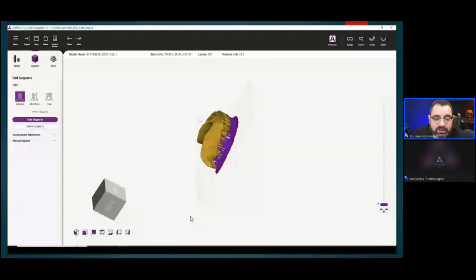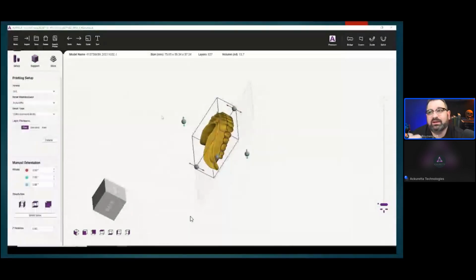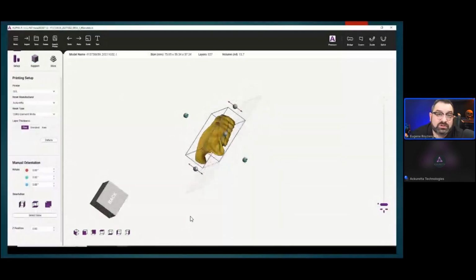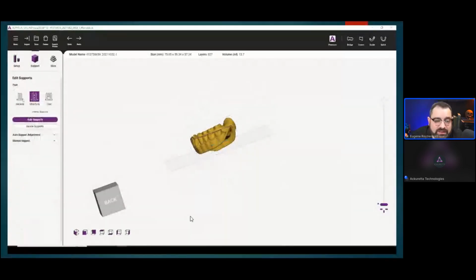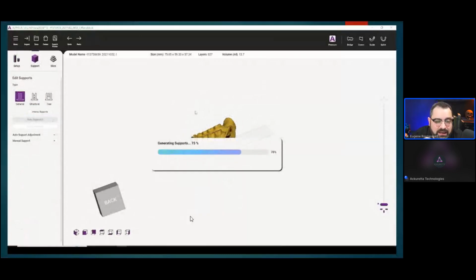This way will get you the cleanest possible intaglio, but you've got all these supports on teeth, which can lead to issues when it comes to occlusion. So what I usually like to do is get the best of both worlds. I'll angle things a little bit differently.